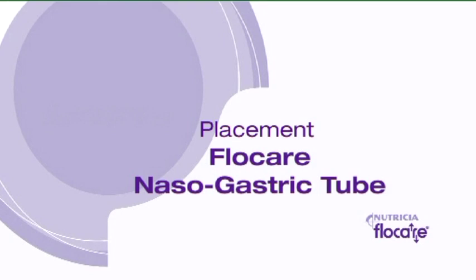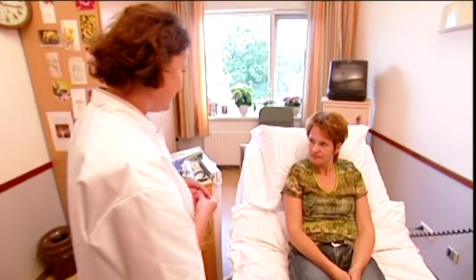Handkerchief. Wash your hands or wear surgical gloves. If possible, explain the procedure to the patient.